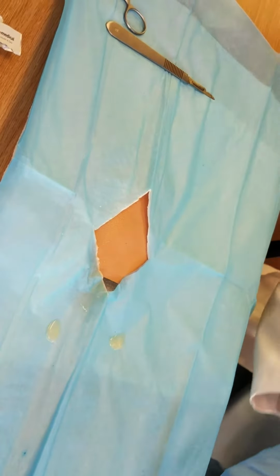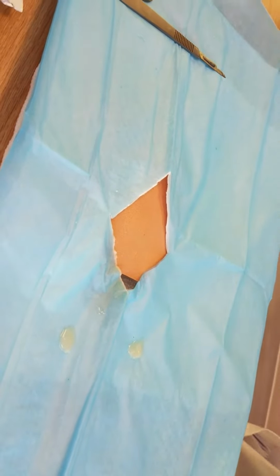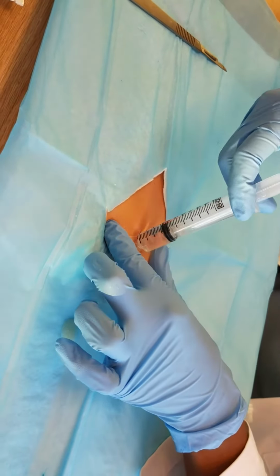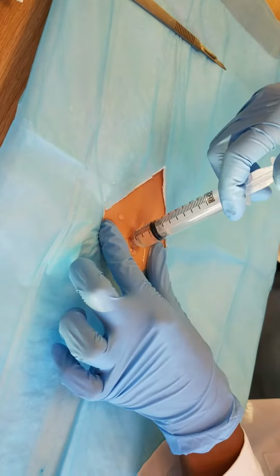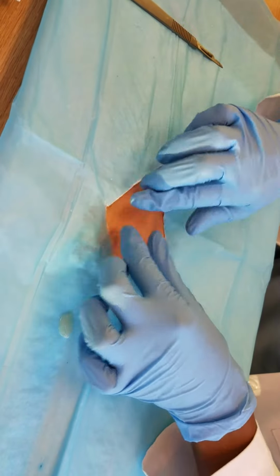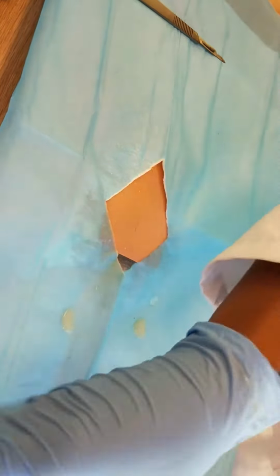Okay, and now you want to thoroughly irrigate the abscess with normal saline before any gauze is inserted. So I'll just push some in there. Okay, just going to slightly pat it a little bit.